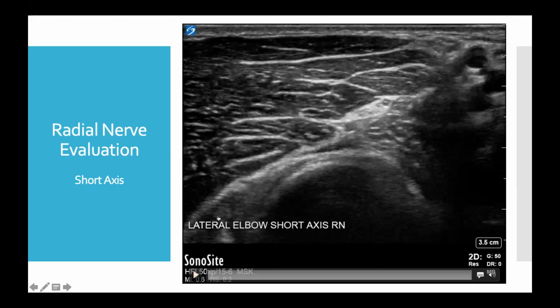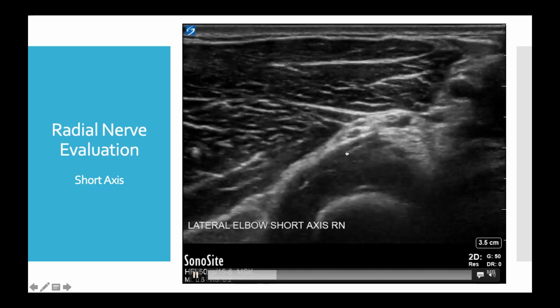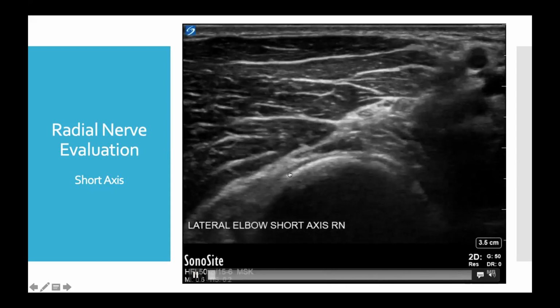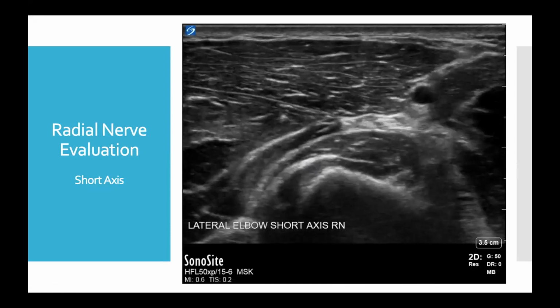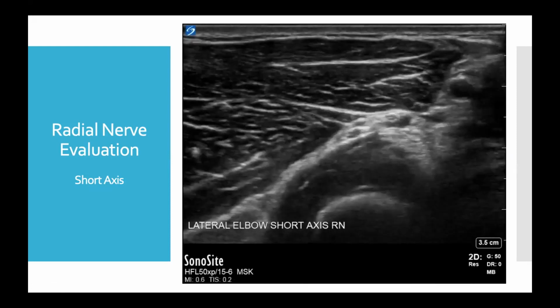And so here it is in short axis. We can see it right in the middle. Our radial nerve is present, and it is right as it branched off, a little bit distal to where ideally I would want to be. But we can follow the posterior interosseous coming down into the septum between the two heads of the supinator, and come right in here. Let's play that through one more time. The main thing we're looking for is any increase in diameter of the nerve, any swelling of the nerve there.